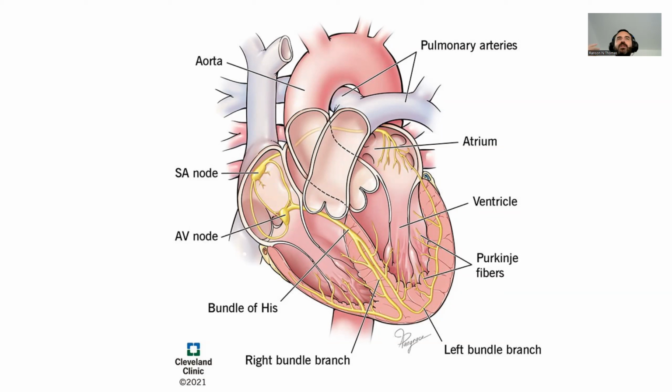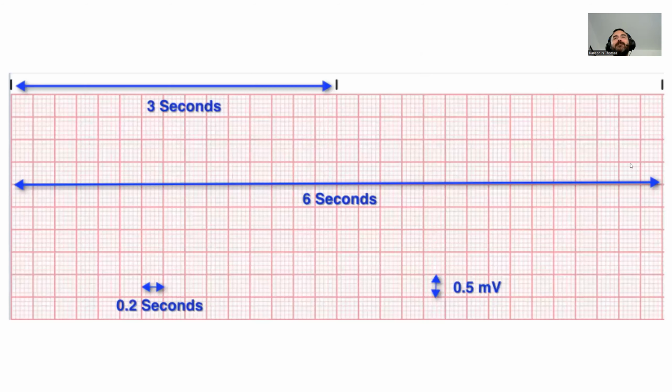And understanding that that corresponds to some problem with the electrical conduction system of the heart, and specifically with that beginning, right, in the atria. Again, hopefully you know all that stuff. Hopefully you do know what a normal P wave length is. But if you didn't, hopefully that'll be a little more useful to you in actually understanding what's going on with the patient.